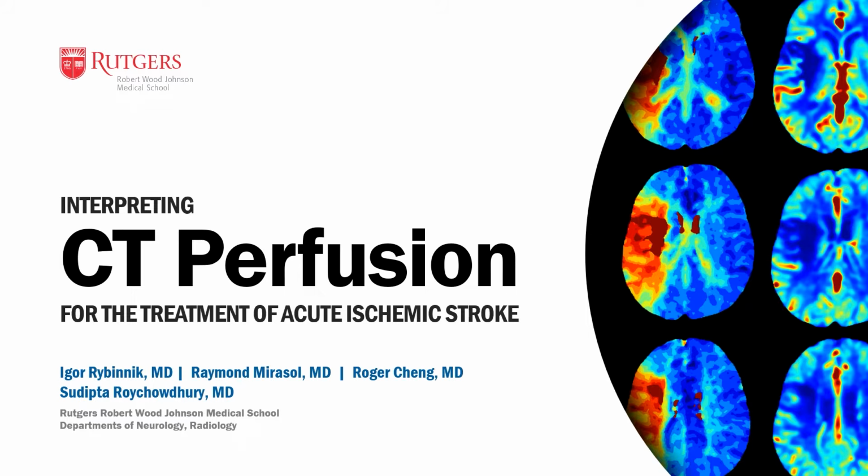Today's topic is interpreting CT perfusion for the treatment of acute ischemic stroke. This talk is a bit long and complicated, but then perfusion is a complicated topic, so feel free to use chapter markers below, slow things down, speed things up, whatever helps you learn.